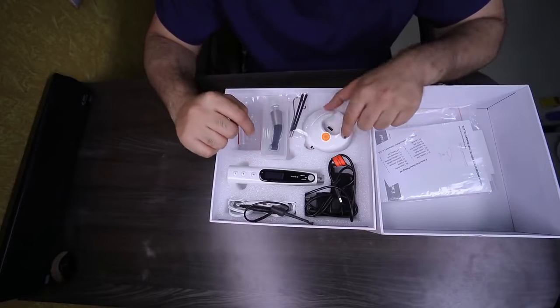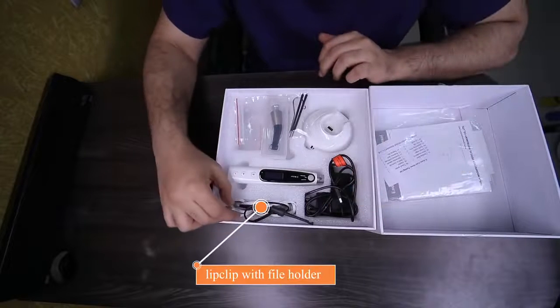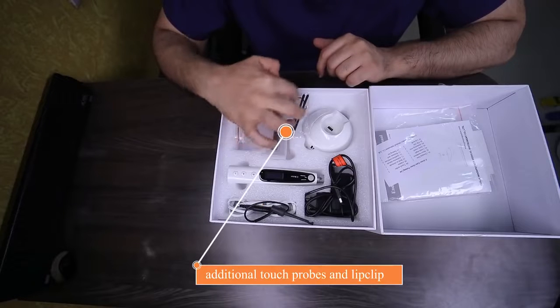You have the docking stand which doubles up as the charger. You have the power plug. You have the lip clip and the file attachment, and you have the accessory touch probes and the additional lip clips.